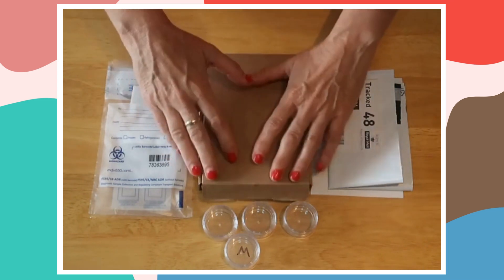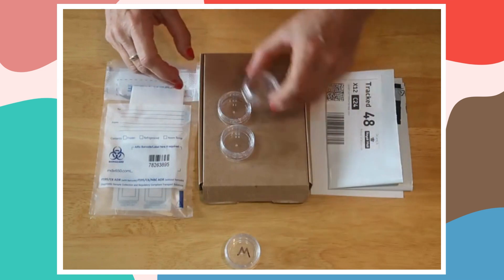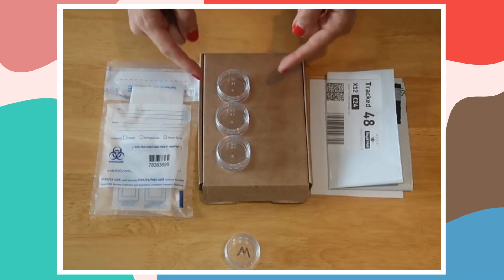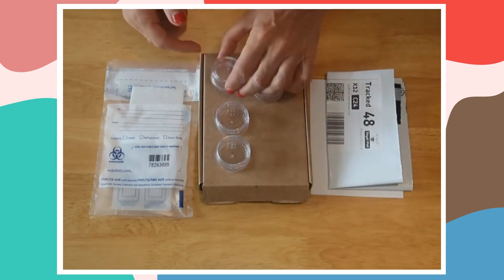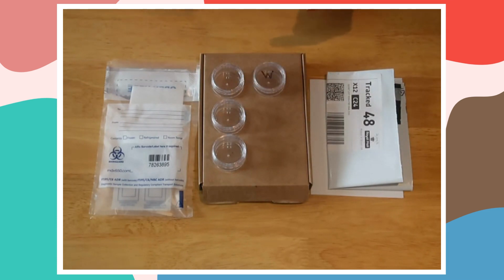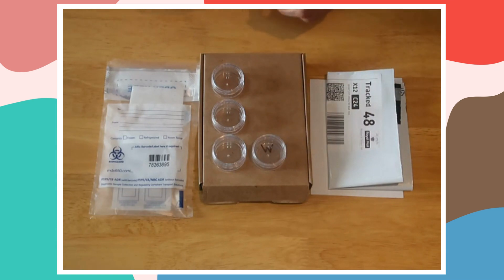With everything that's in there, the lung worm test is a three-day test. You have to take a sample on each consecutive day, and on the last day you do your worm count. On Monday, Tuesday and Wednesday you're going to take a sample of your dog's poo, and on Wednesday — the last day — do the worm count test as well from the same sample. This is because you need samples that are as fresh as possible.